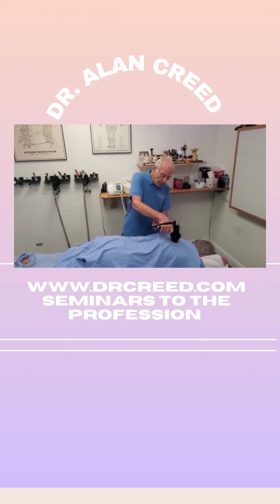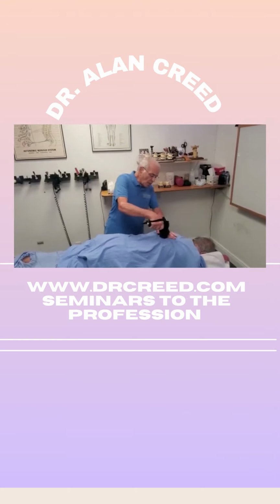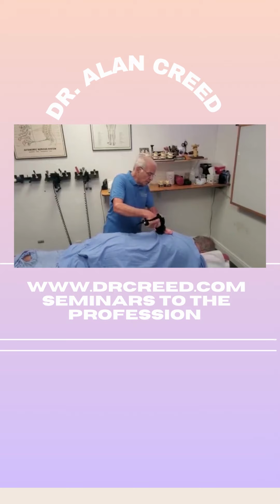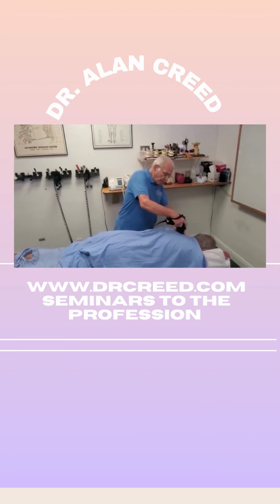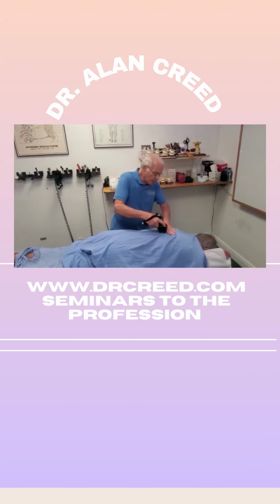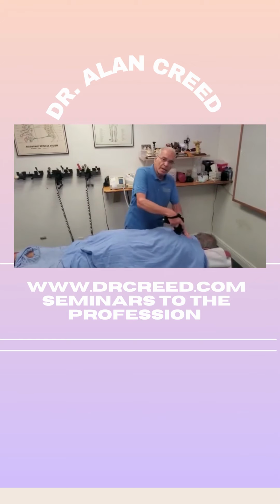So what we're doing is we're percussing the muscle in a way where we can control the amount of power that we put through here. What we're doing right now is opening up these areas and we're flushing. I'm flushing this up. Now, the lower it goes, the deeper it gets.